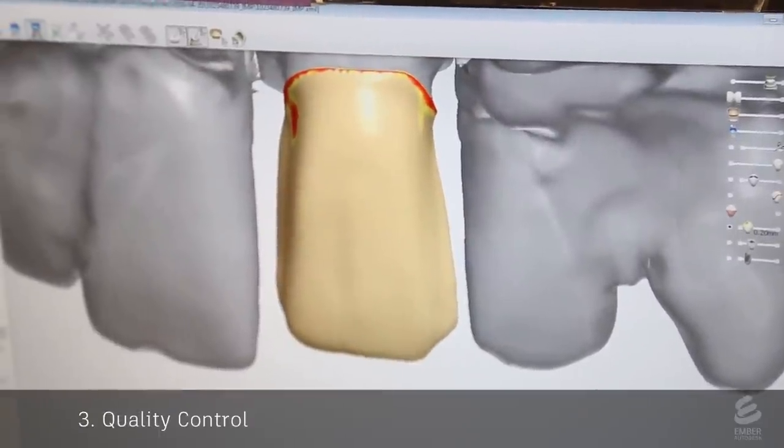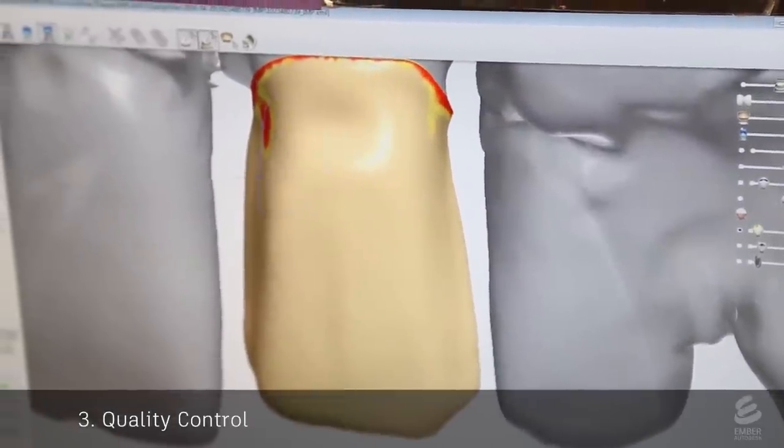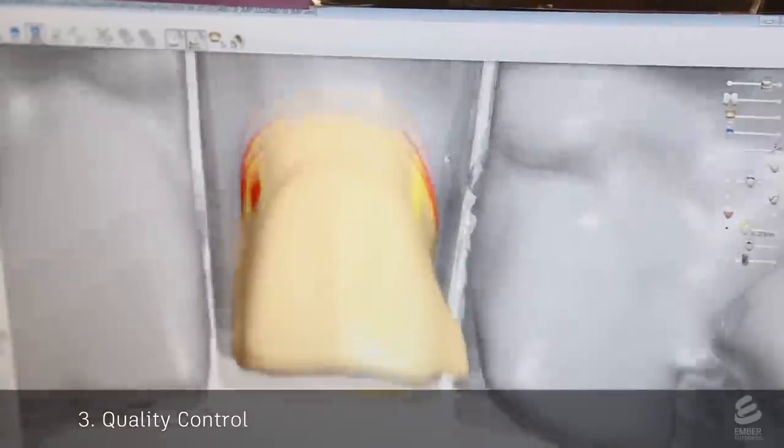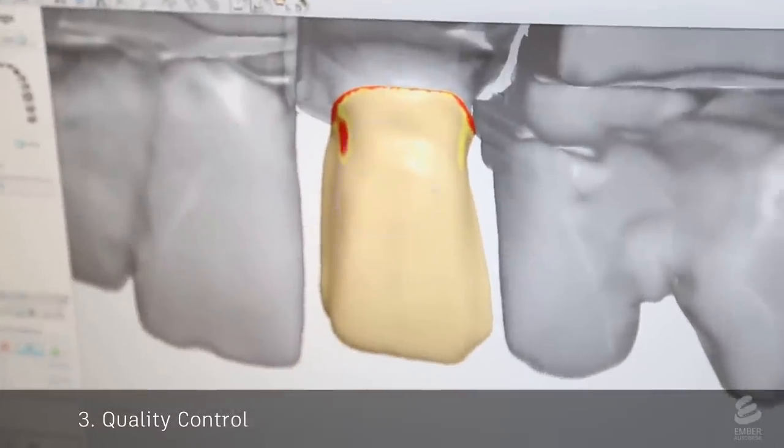This digital mesh is sent to a second technician who performs quality control. This is similar to the previous step, but this technician is more experienced and makes sure that the shape of the tooth looks natural.